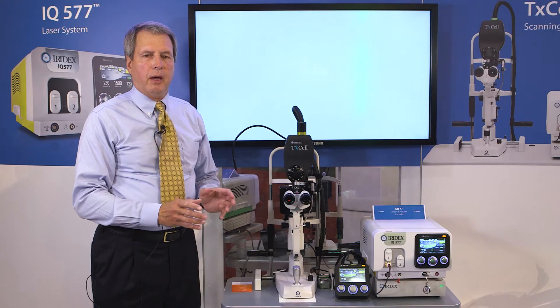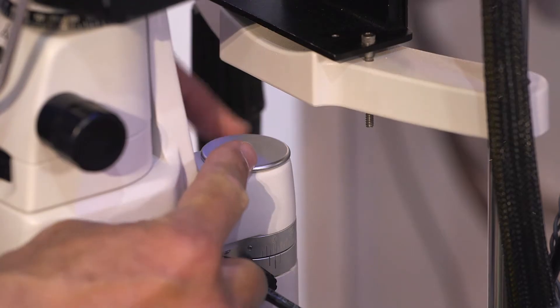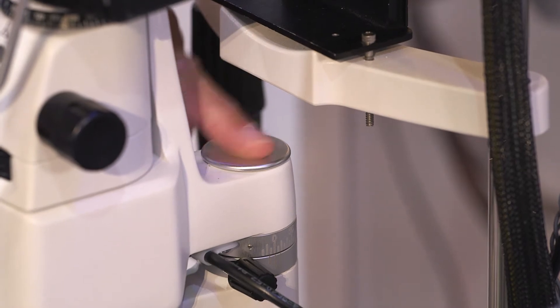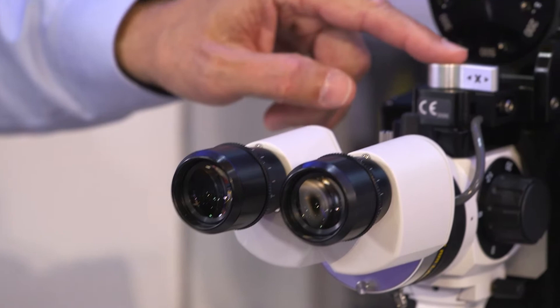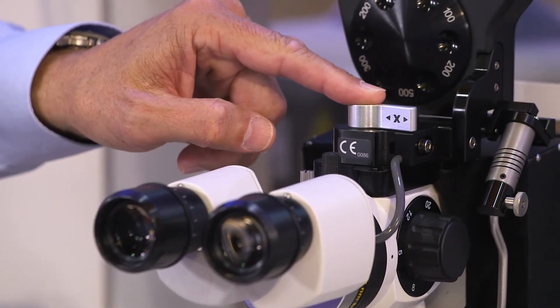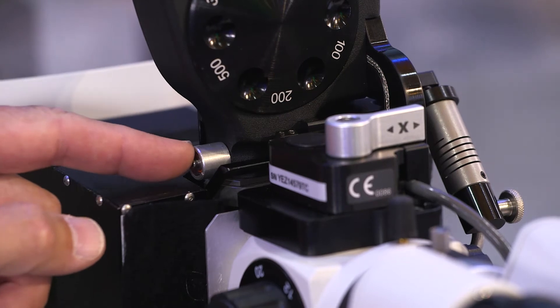What you'd like to have is a focusing post, which is an inserted aiming post. We're also going to be using the oculars, the horizontal aiming beam adjustment, the spot size selector, and the fine focus micrometer.